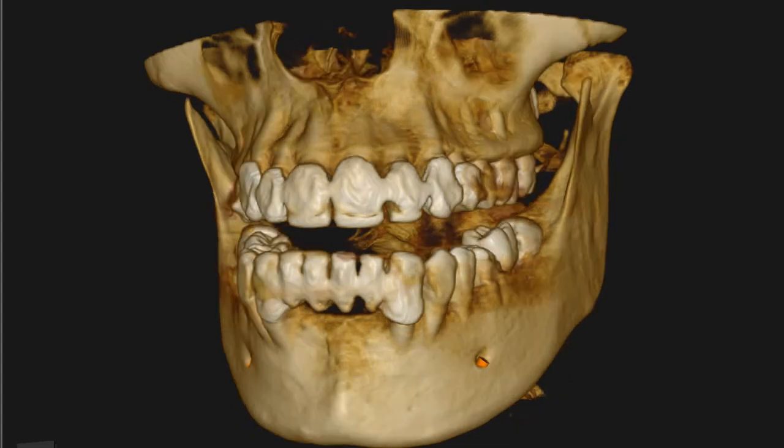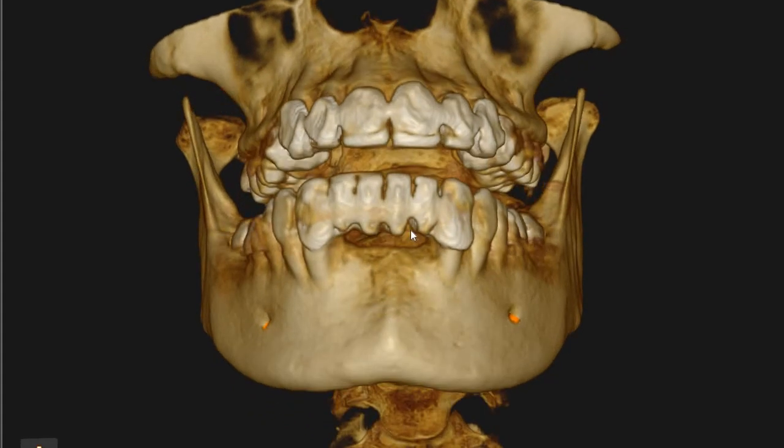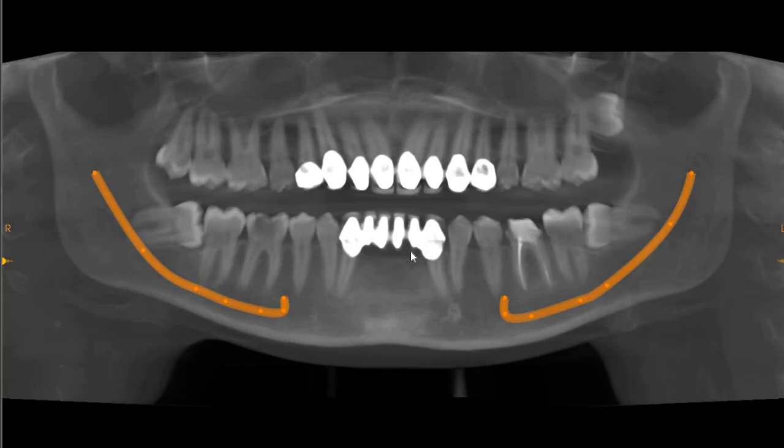This is the CBCT of the patient that you had requested. The area of interest highlighted is the lower anterior region. The kind doctor wants us to assess for implant placement underneath this old 6 unit bridge. On the panoramic view, we see that we have bone in the edentulous ridge under the anterior incisors. We will place implants for the kind doctor to evaluate how we've placed them.